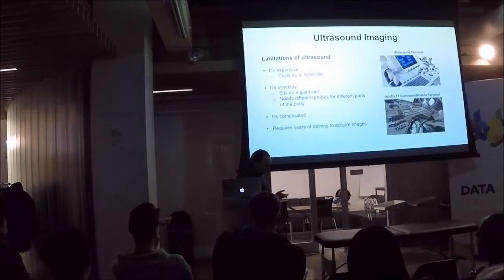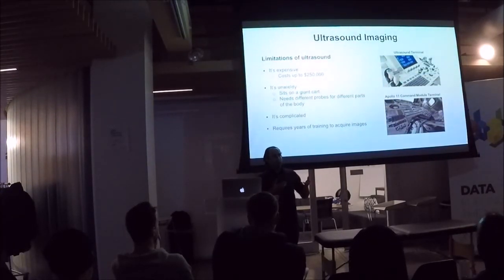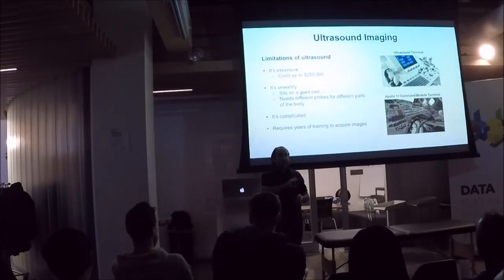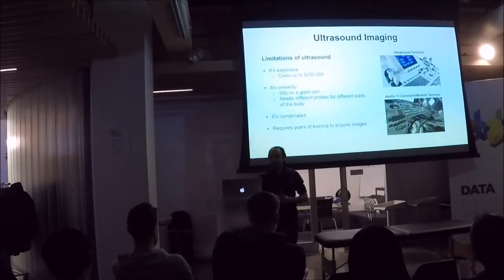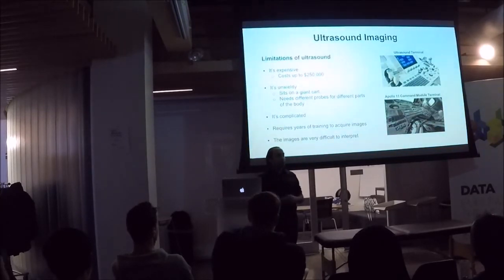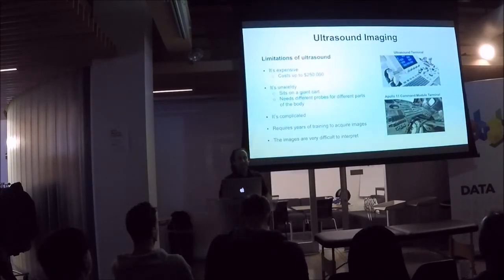So this is really one of the difficulties of ultrasound, is it's very operator dependent. So if you call to get an exam, you plop an ultrasound on some part of your body, and the exact angle that you hold the probe will radically change the image. So it requires a lot of time, not only to understand exactly how to hold the probe, but also how to interpret it. It's very, very difficult to interpret ultrasound images because of what the modality is. It's a slice through the body. So when you look at an ultrasound image, it's often not intuitive at all.